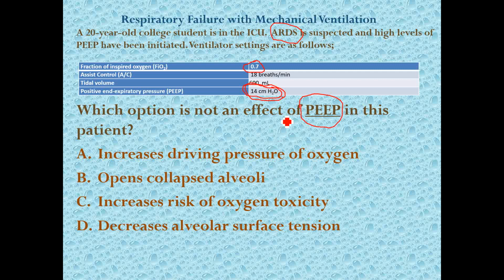So what doesn't it do? Again, a trickery. The question asks what does not PEEP do, and that is it doesn't increase O2 toxicity.